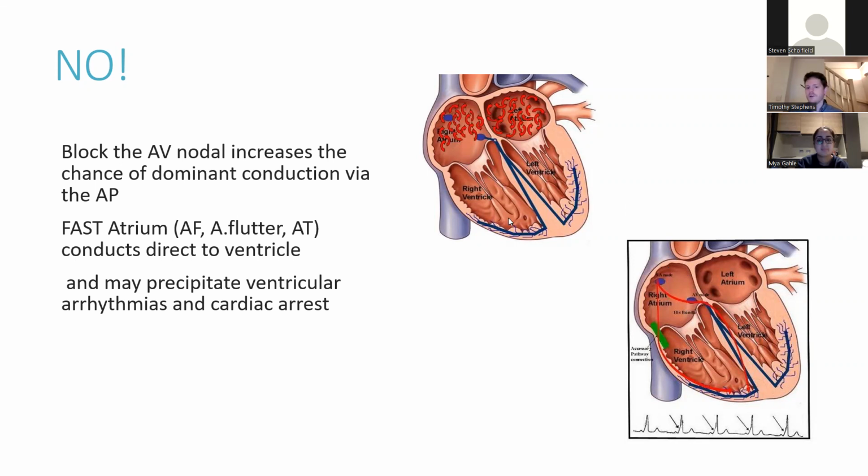So what would be the consequence of that then? Somebody put in the chat. The consequence of these fibrillatory waves conducting down through this accessory pathway into your ventricle. So I see a question here, I'll come back to that actually. Somebody's asking, so you turn orthodromic into antidromic. I'll come back to that, but just in terms of, yes, somebody's put VF. Pretty much you're basically taking fibrillation effectively.